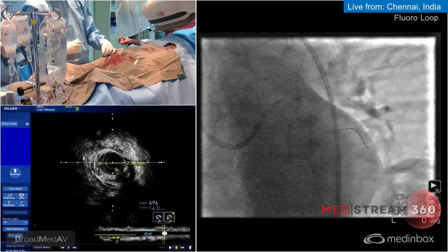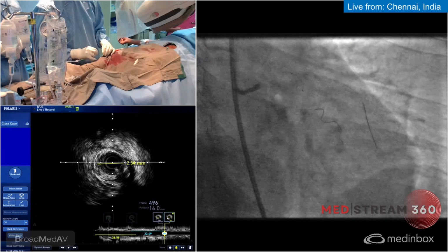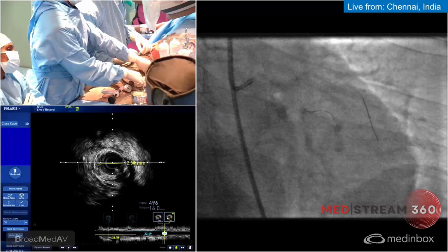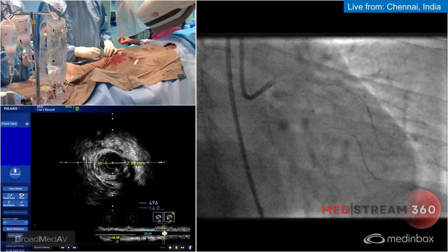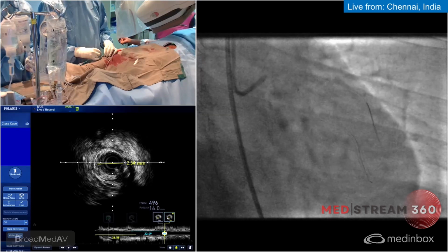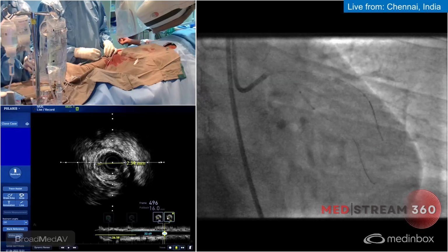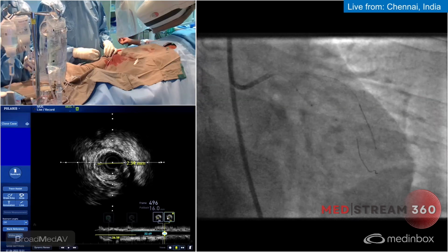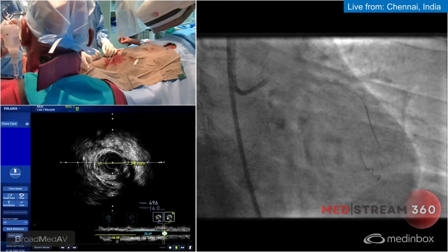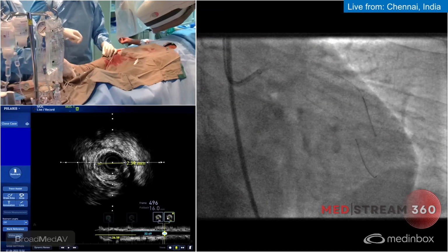So what is happening is that the balloon is hitting the top and pushing back at the left main circ junction, because there is no chance that this could entwine now. Okay, so let's go very low inflation pressure, please. Normal is at 10, is it? 12. So let's just go 5, 6, 7. It's a bit oversized. So there is a concertina effect. You can see that there on the wire. So we need to be careful that we don't mix up that.